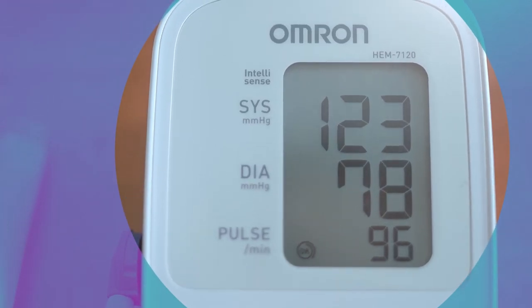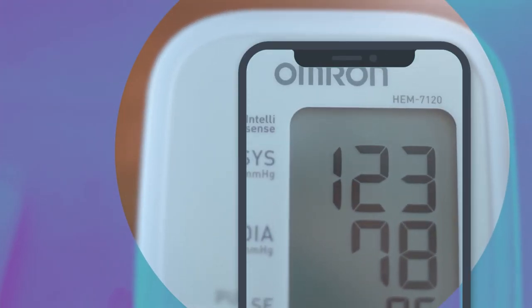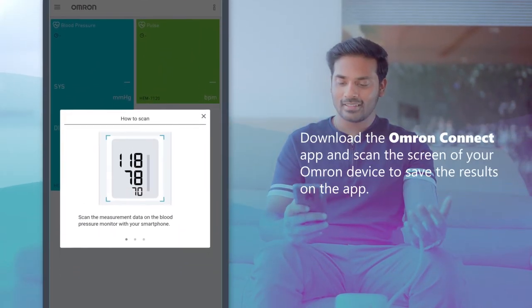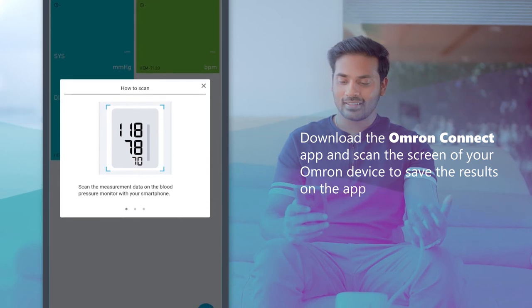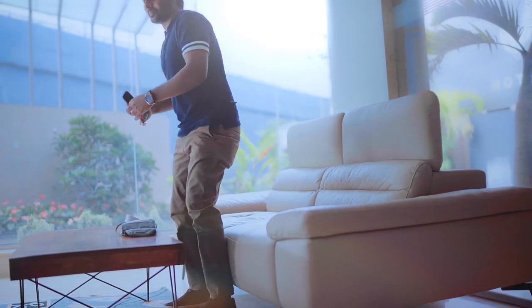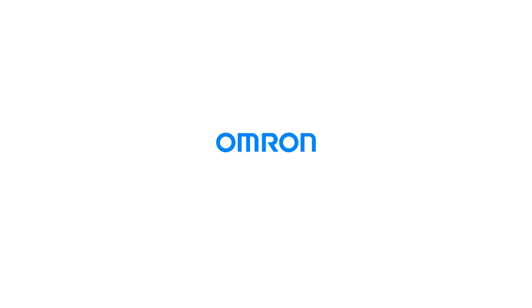The large display serves another purpose — it talks to our mobile app, allowing you to track and share your progress. Download the Omron Connect app and scan the screen of the monitor to save the results on the app. Keeping track of your health is now easier than ever with Omron.